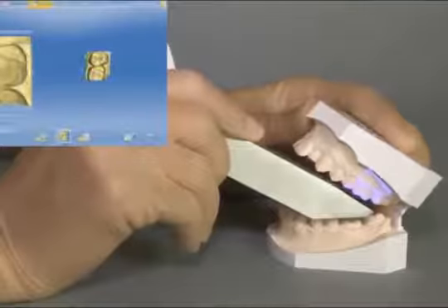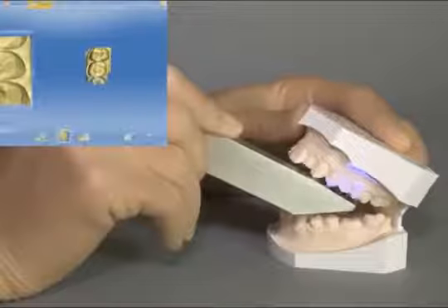Sometimes, with real intraoral scans in the dorsal part of the mouth, it is advisable to remove the support from the camera to allow better maneuverability. On the upper jaw, we also begin scanning distally with overlapping exposures towards mesial.